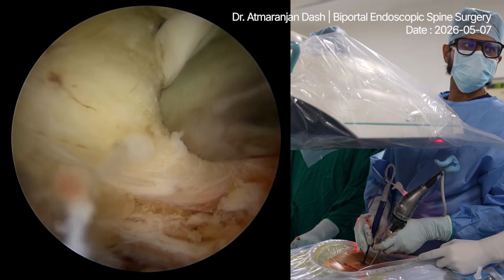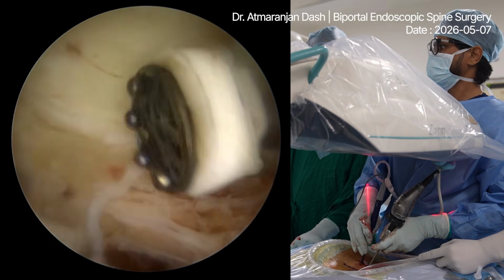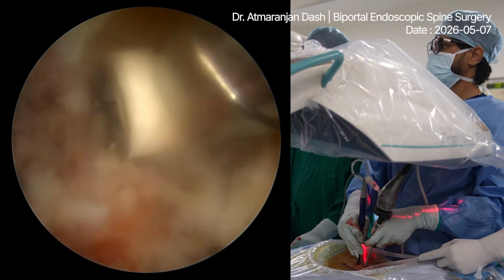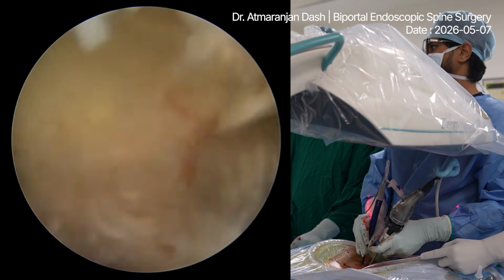Shoot. Shoot, please. Coagulation. Okay. So this is the foramen. Coagulation. Alright.